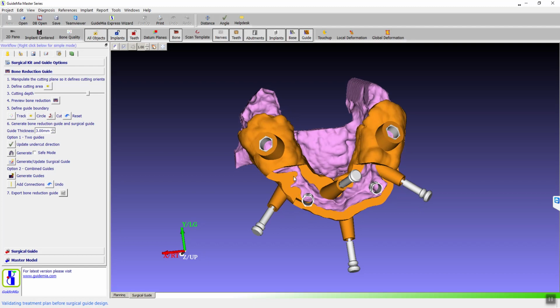Yeah, I think if I was drilling the holes, I would rather have it click in well. I see. This, when we're looking at it, we have a Chrome guide we're holding in our hands here, and it actually has pins that hold it in place anyway, because that's sort of pre-made. We can do that too. They're working on the Chrome style design.